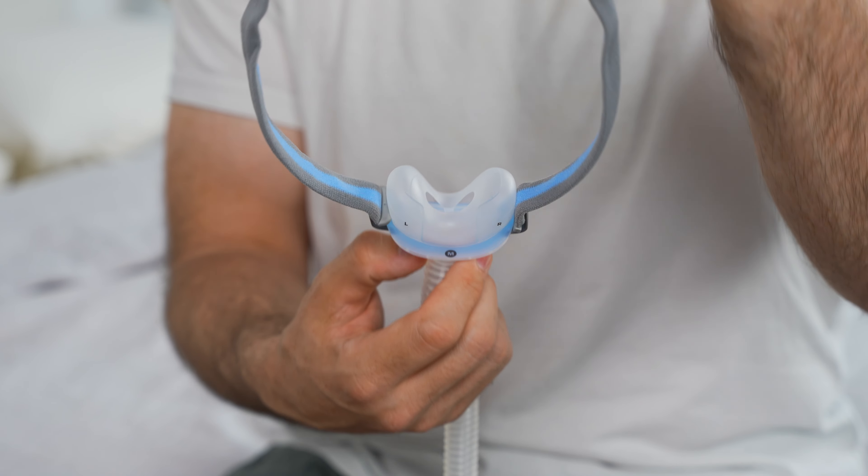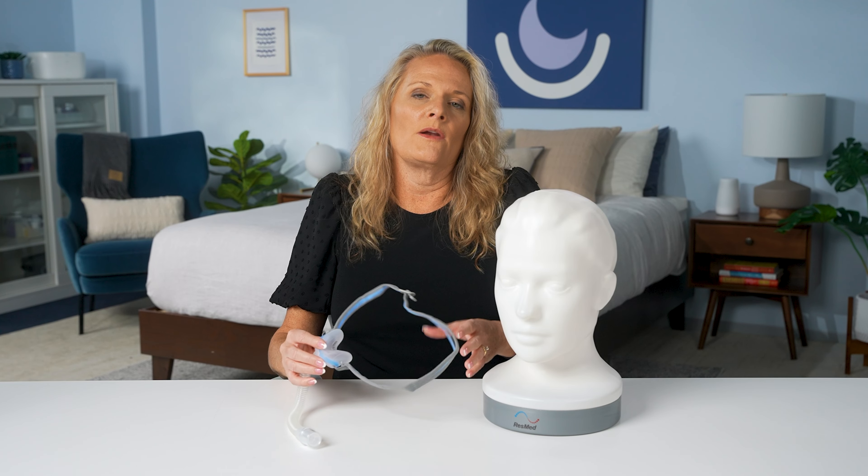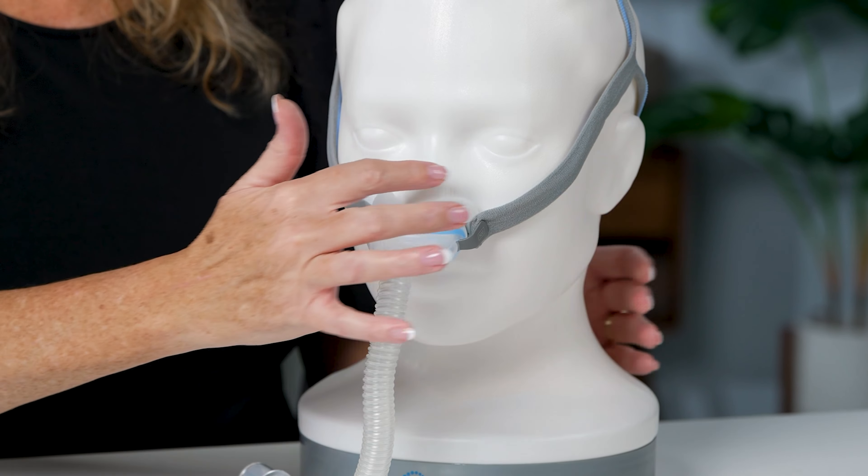The next mask style is called the nasal cradle mask. This mask is similar to the nasal pillows, but instead of the pillow design that enters the nostrils, it uses a single cradle with two air holes and your nose rests directly on top. To fit it properly, just like the nasal pillow mask, the sides go at the bottom with left and right indicated. Place the cradle just below the nose and pull the strap onto the back of the head. The straps should separate — one at the base of the skull and one on the top of the head. Ensure the cradle sits just underneath the nose in its normal position — it shouldn't be pushed up. Make sure the straps are on the tops of the cheekbones and feel around the outside edge for any leakage. If there is leakage, reposition and tighten if needed.